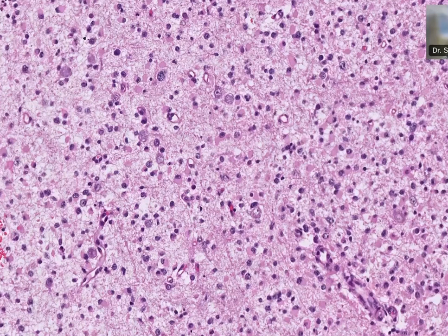I can advise you something when you're describing a tumor. First, you describe the shape of the cell. You say in this field there is a tumor with a mixture of cells of varying sizes and shapes. Some of them have dense eosinophilic cytoplasm, or you can say plump cytoplasm, and some cells have hardly any cytoplasm. They are not similar to each other. No two tumor cells look similar, and they are of varying sizes and shapes. These are the features of an astroglial morphology. So I'll put it as astrocytic.